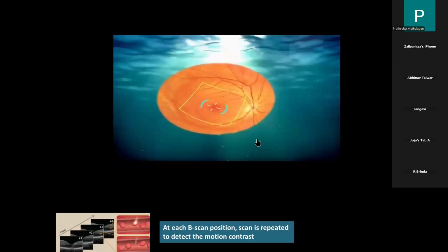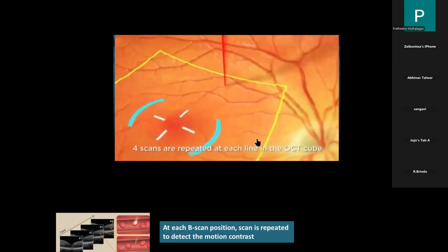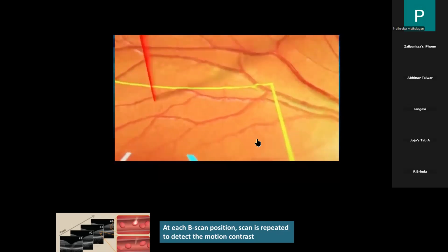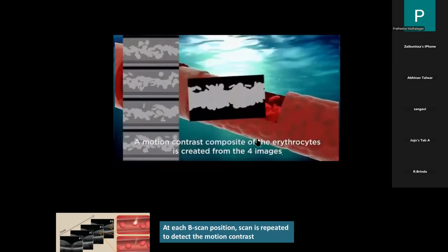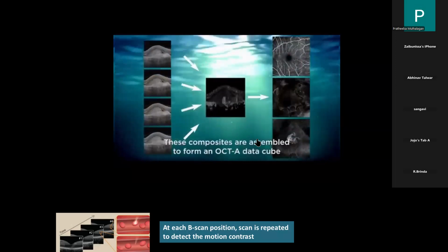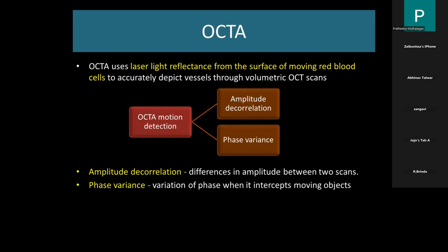Let me show you a video of the principle of OCTA, how it works. At each B scan position, the scan is repeated 4 times. The 4 scans are repeated at each line in an OCT cube. So these are the moving erythrocytes. When the light passes through this, these 4 images create a motion contrast composite of the erythrocytes, and you get a clear-cut image like this, and an OCTA cube is generated. So basically, laser light reflectance from the surface of the moving RBCs is used in OCTA as a principle. So we use something known as amplitude decorrelation.